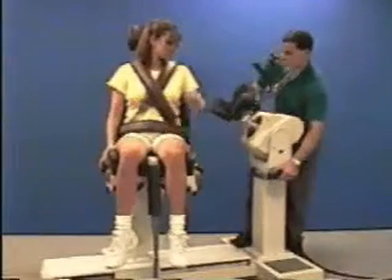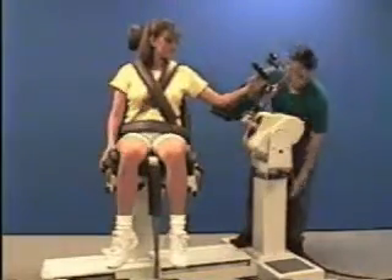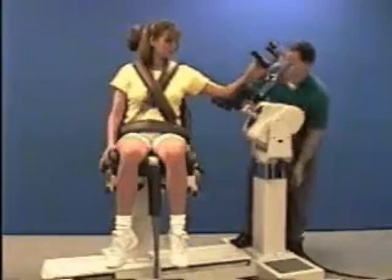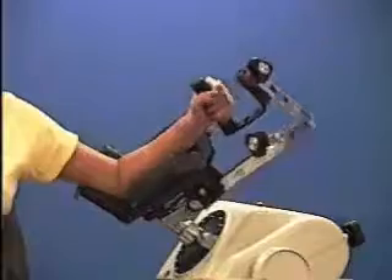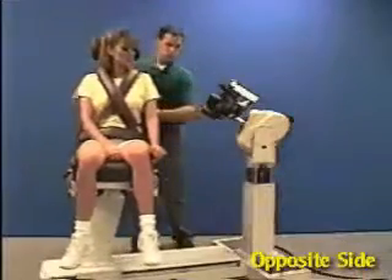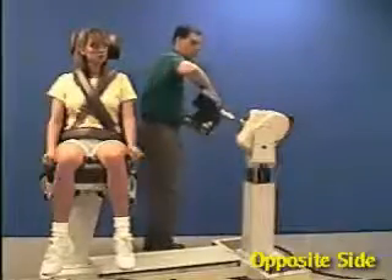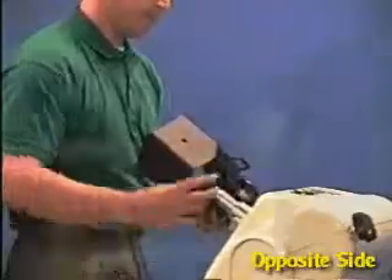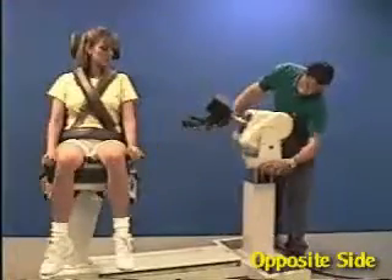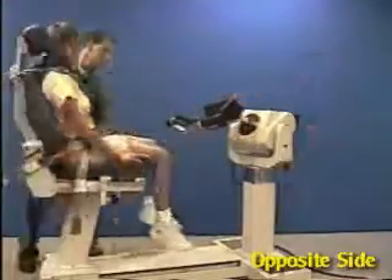Check the range of motion. Slide the chair back, remove the fixture, rotate it 180 degrees, and reattach it to the shaft. Rotate the dynamometer to 20 degrees and the chair to 15 degrees on the opposite side.